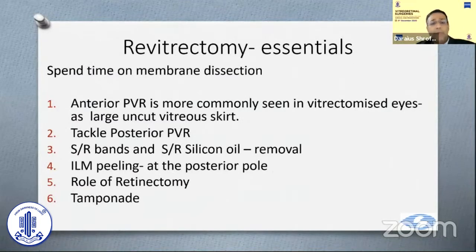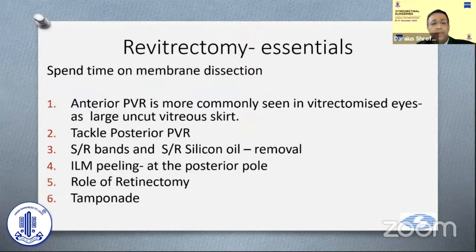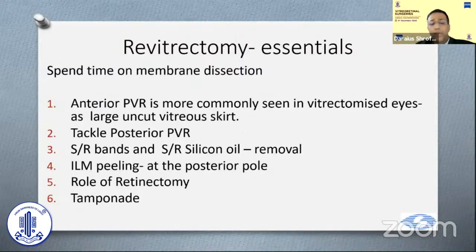Spend time on membrane dissection because anterior PVR is more common in these vitrectomized eyes, as there's a large skirt of uncut vitreous in the periphery. Then go back, tackle the posterior PVR, tackle the membranes and subretinal oils, then do the ILM peeling if required. The role of retinectomy and tamponade will also be discussed.